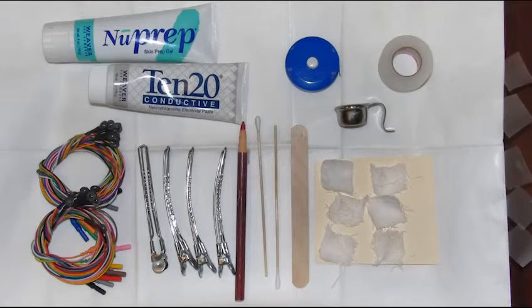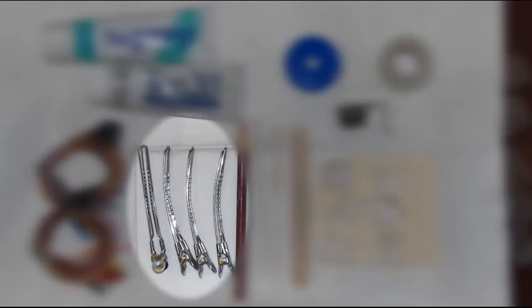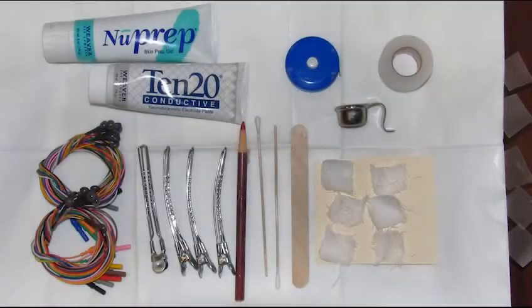Here I have my supplies laid out and ready for the patient. I have electrodes, hair clips, a skin marking pencil, cotton swabs, a measuring tape with centimeter markings, a tongue blade, and I use a pumice cup. I also have cut gauze squares to a postage stamp size, and here I have some tape already cut for the electrodes that will be placed on skin where there's no hair.